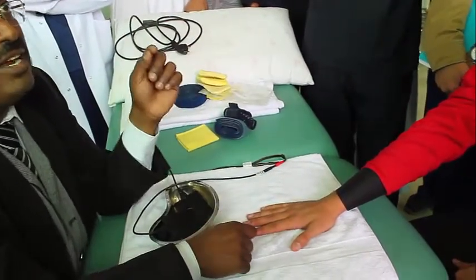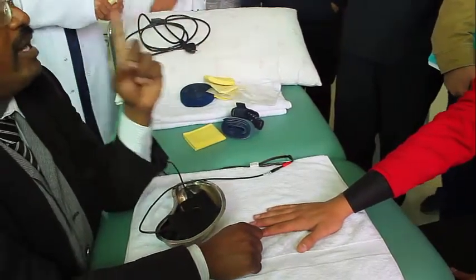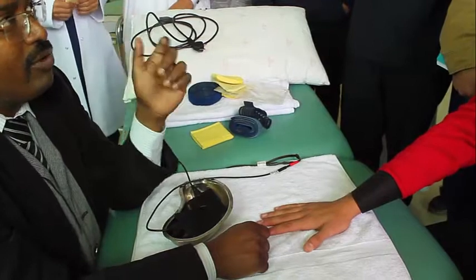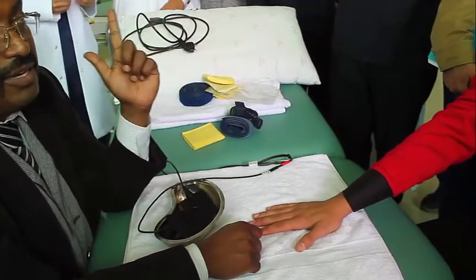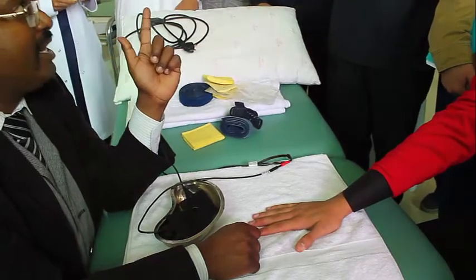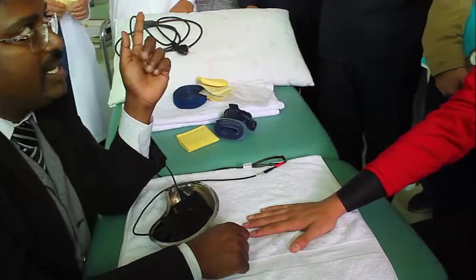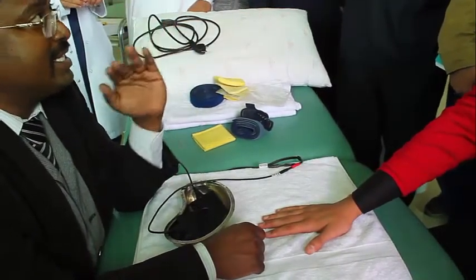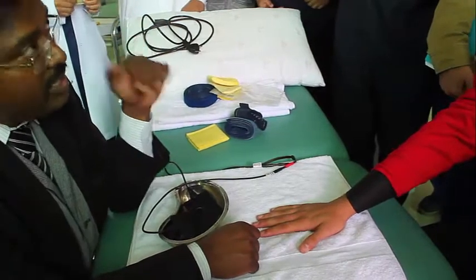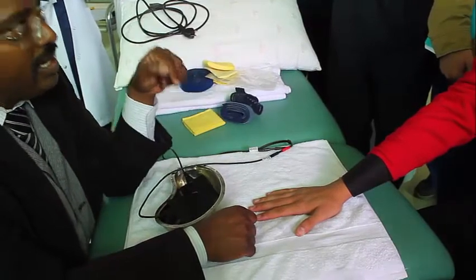So this is the reason why you have to decrease the resistance of the skin. This is one of the commonest practical questions, I am telling you. Why decrease resistance of the skin? Because, I will tell again, skin is an insulating material. Skin has sebum, skin has oil, skin has dirt. Skin pores do not allow the electrical current to go inside because it is a dry material. So you have to go inside the skin because you are going to stimulate a muscle or some structure under the skin.